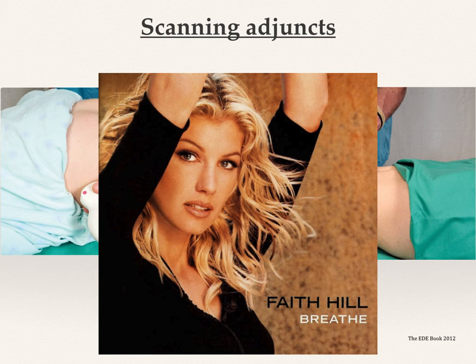Okay, no, seriously. What you can sometimes do is have the patient take in a deep breath and hold their breath on inspiration. That may help pull, as they contract the diaphragm, it's going to pull the liver down and therefore the gallbladder down into a more visible window.